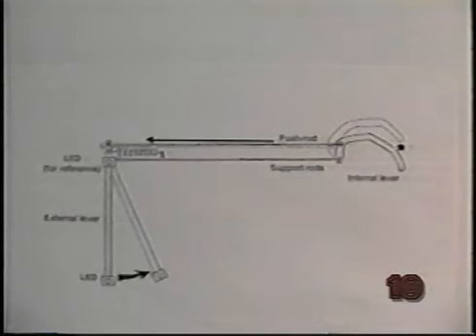In this drawing of the velotrace, we see its three major parts: an internal lever, an external lever, and a push rod between them, all carried on a thin support rod. The levers are connected to the push rod so that when the internal lever is raised, the external lever is deflected toward the subject. The device is loaded with a small spring to improve its frequency response, and thus the ability of the internal lever to follow rapid downward movements of the velum.